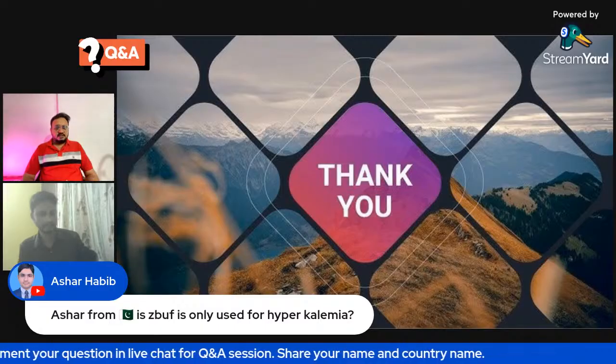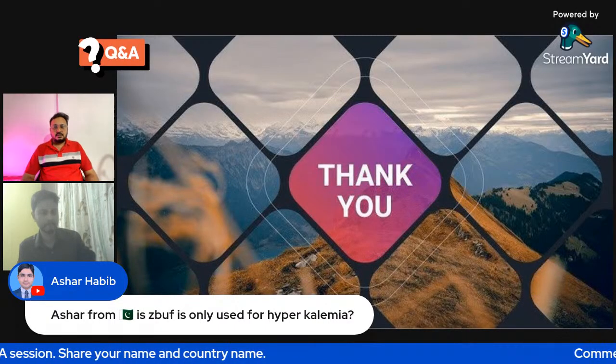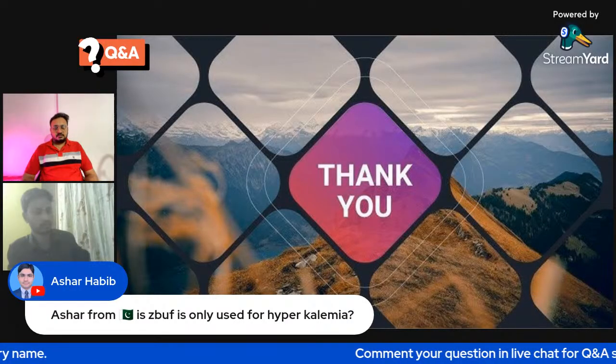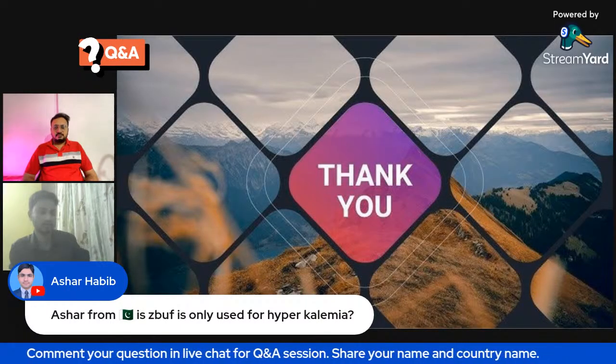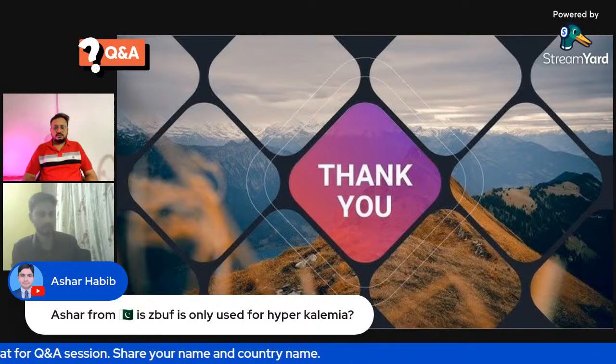So his question is, is zero buff only used for hyperkalemia? No, sir. It is also useful for removing inflammatory mediators, and for removing lactate, and there are many other benefits, sir. Not only hyperkalemia.